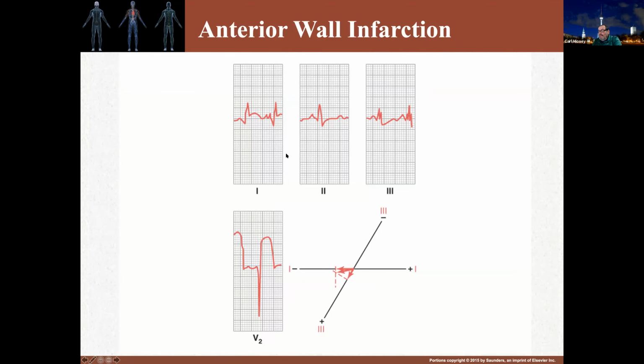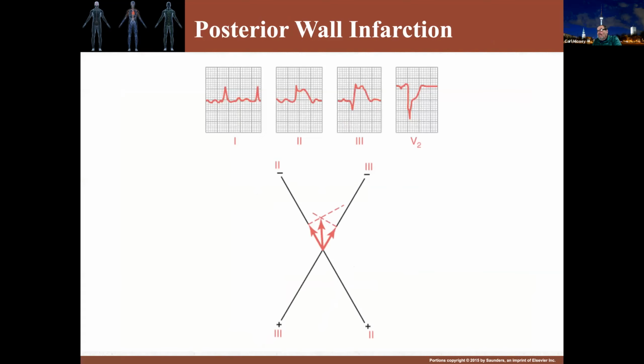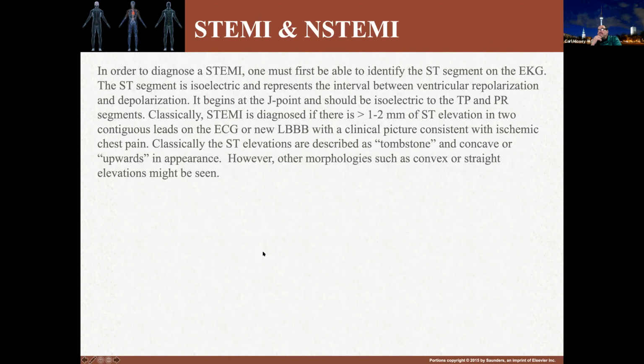And this is showing you an anterior wall infarction. And here you have posterior wall infarction. Notice the direction.